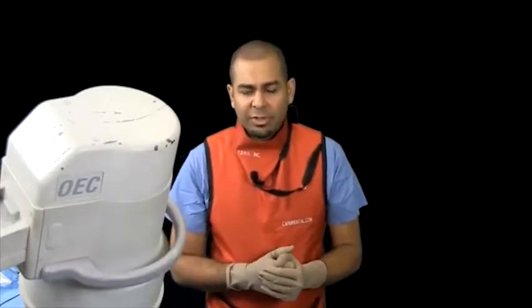Following the procedure, I remove the probes and the needles, ensuring that the probes are intact, and I have a brace placed on the patient while they're in the prone position. They then move on to the recovery room stretcher with the brace on, and I restrict hip flexion for several weeks following the procedure. We also have the patient go through a very regimented recovery and physical therapy protocol to ensure optimal healing time. This procedure, the transdiscal biacuplasty, again, is appropriate for patients with internal disc disruption and discogenic pain confirmed by provocation discography.